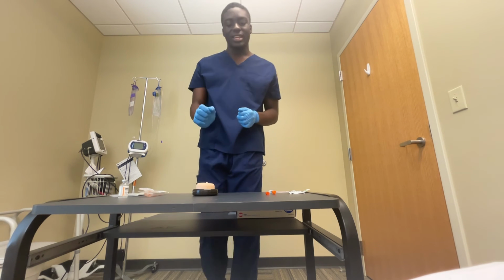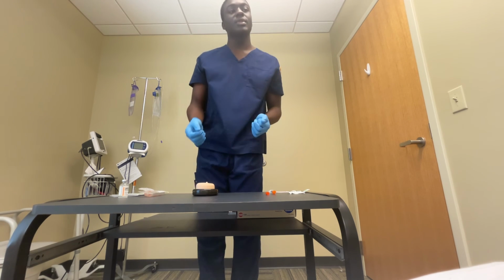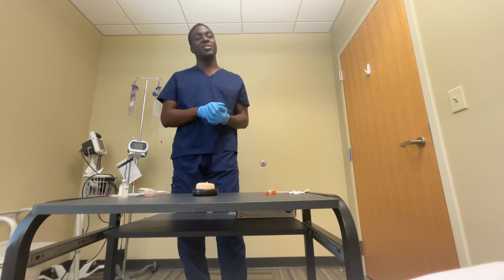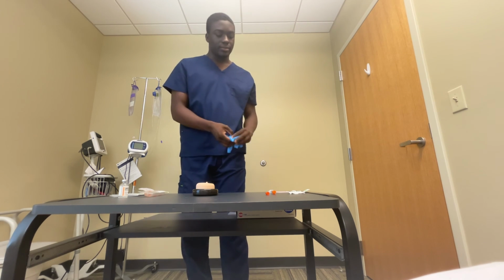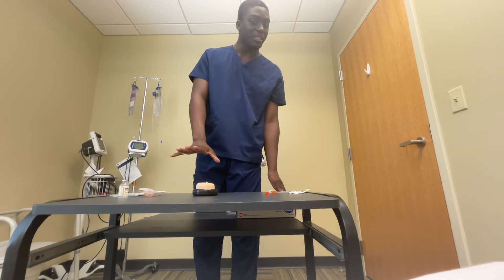And then I will take a pen and annotate the dimensions of the wheal. And then I'll ask him not to rub or itch at it and try not to lay or put any pressure upon it. And let me know if you feel any itching or burning sensations. And then I'll remove my gloves. Hand hygiene. Clean up my area, but for demonstration purposes, I'm going to keep it as it is.